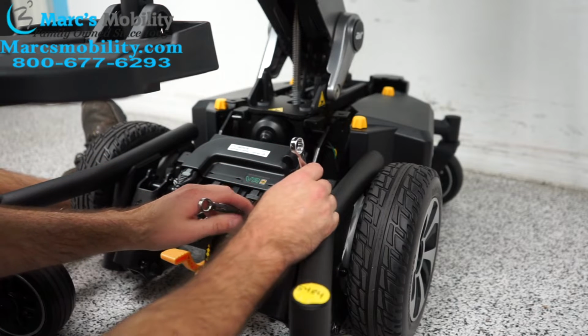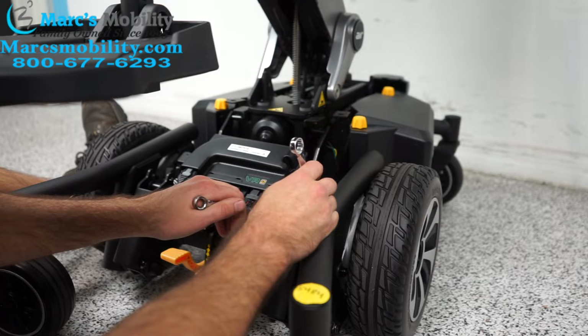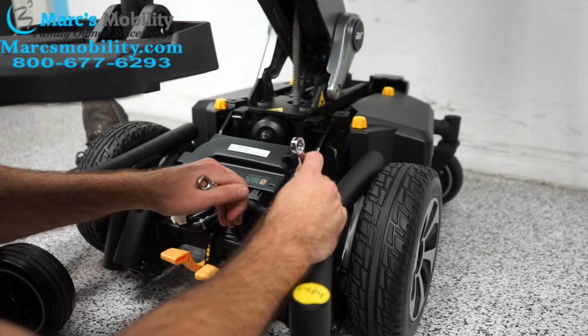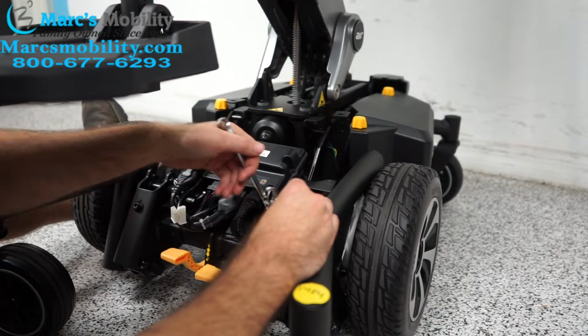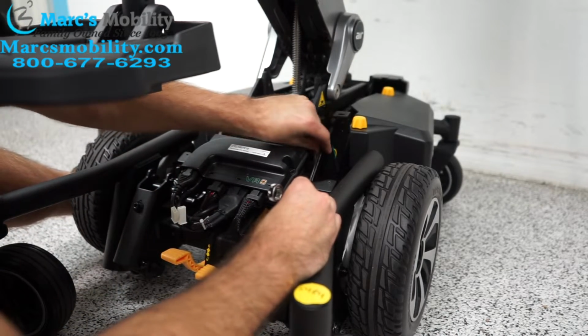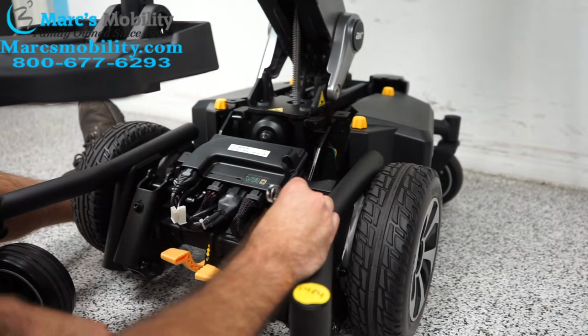Now I would not tighten it any more than about 1/2 turn or loosen it more than 1/2 turn. So I'm going to loosen this and you'll see the sensor go out just a little bit. Do a full 1/2 turn. Very slightly moved. And now it's got way more wiggle room than it did earlier. And it is less likely to get stuck.